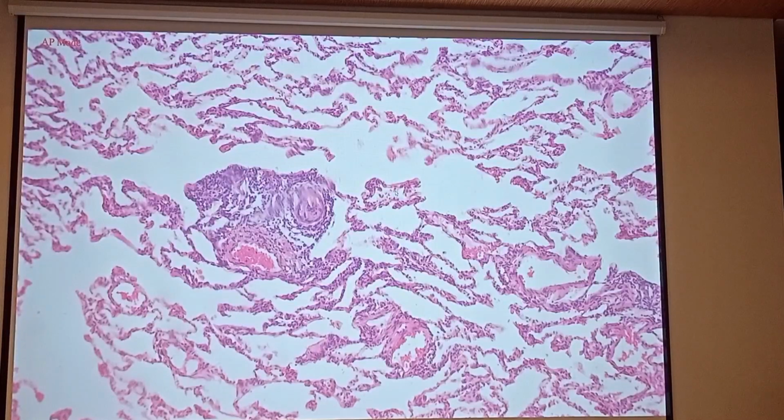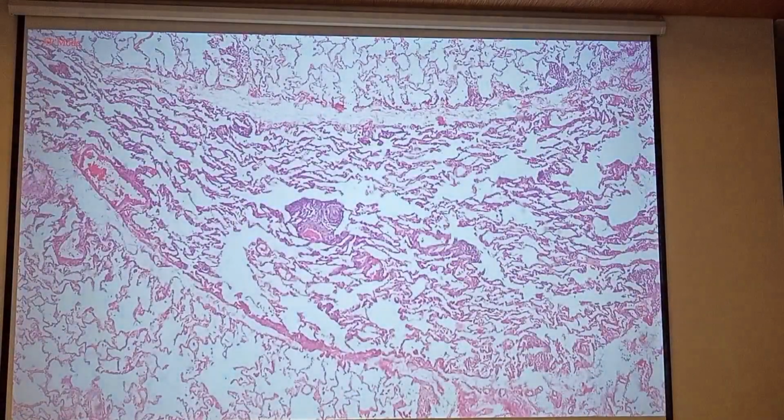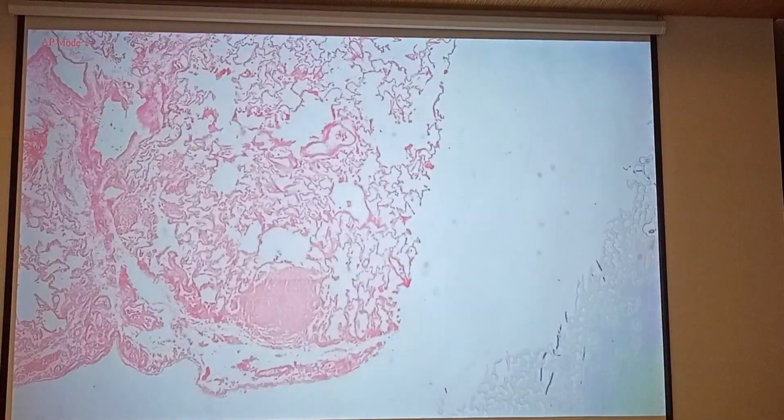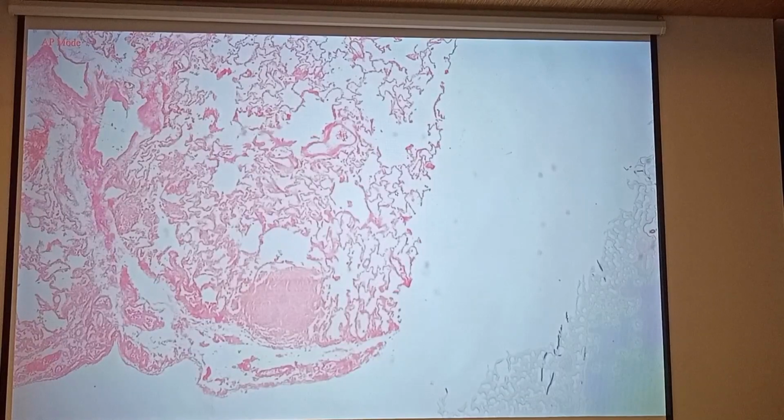Oh, another giant cell. Yeah? Another lymphoid infiltrate, another granuloma. Okay? So, pretty easy to identify, really. So that's a pattern of chronic inflammation. Unlike in acute inflammation, there are basically 4 patterns, right? Can you remember some of them?